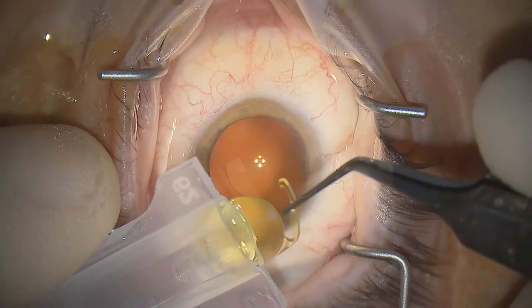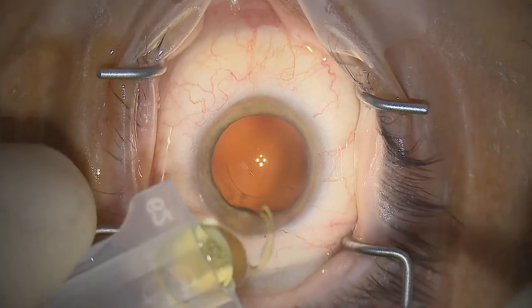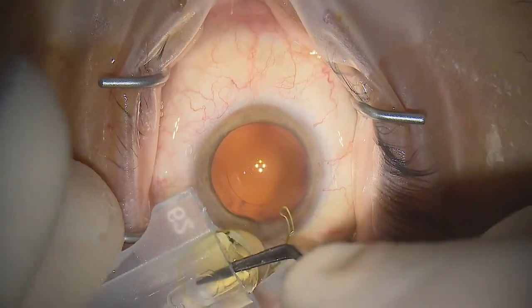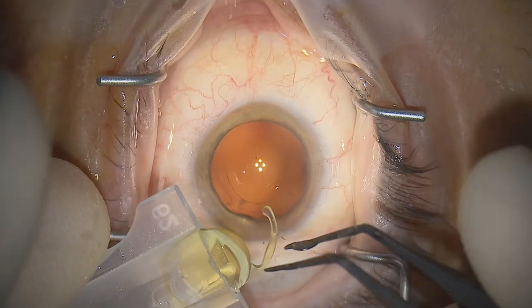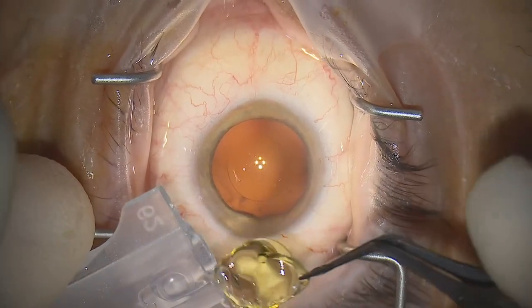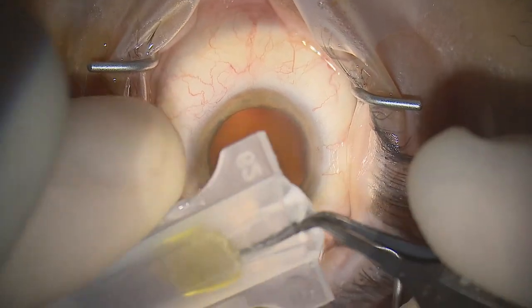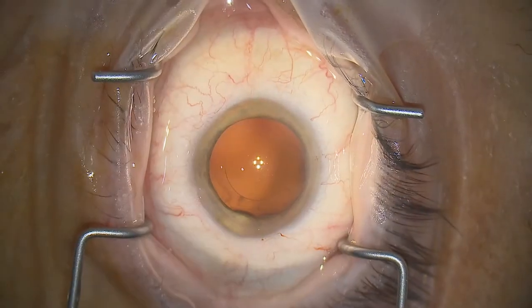The cartridge is filled with viscoelastic and the lens is introduced by the trailing haptic. We reach across the optic, squash down the distal edge before picking up the posterior haptic again to fold it into the now concave lens, then bring out the lens to also fold the anterior haptic within the optic.